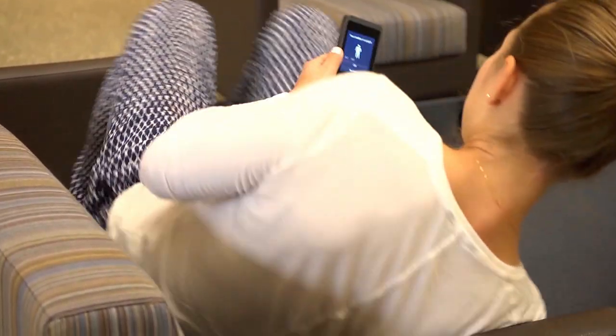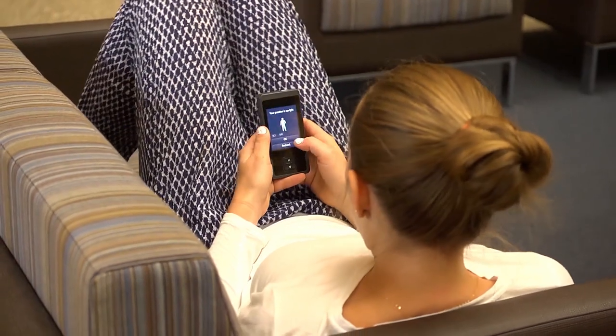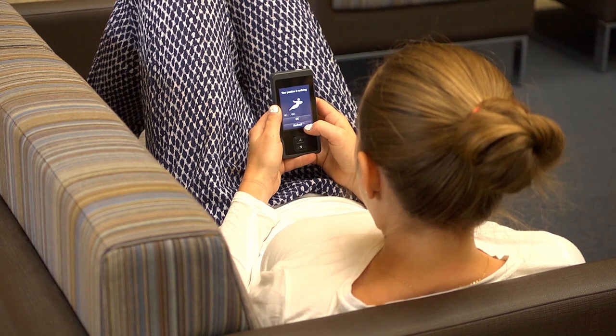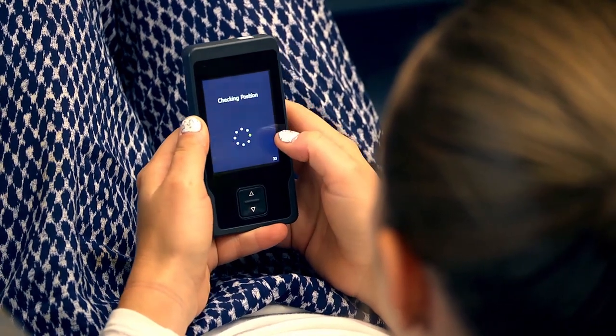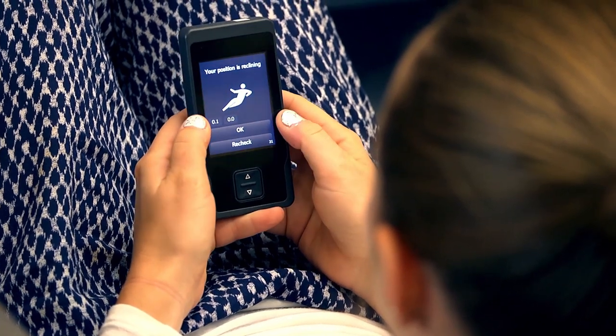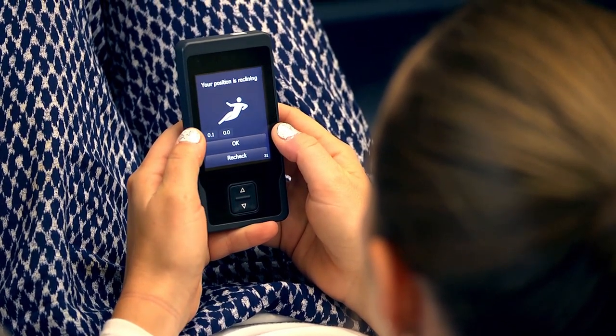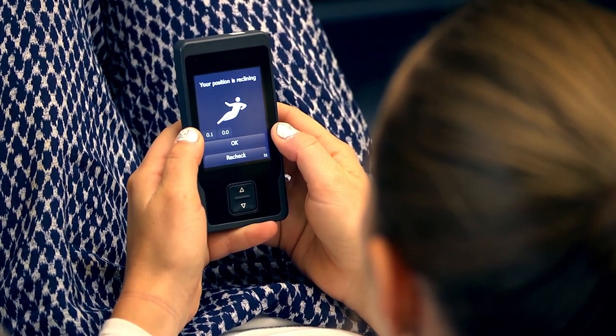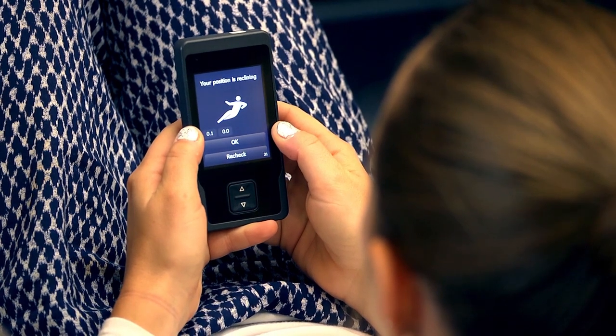First, place your body in the position you would like to make adjustments to. Then, press the menu button and use the check position feature to confirm that the neurostimulator recognizes your body position, and then make appropriate adjustments to your intensity settings. You may need to stay in your current position for up to five minutes before the new intensity settings are felt. Your clinician can adjust this length of time, so you should confirm with your physician the length of time you will need. The next time you return to this position, the intensity settings automatically change to the newly recorded settings.